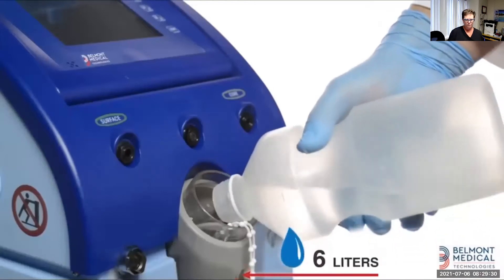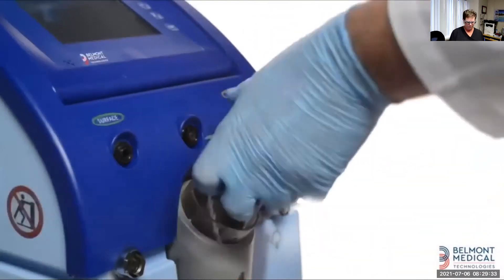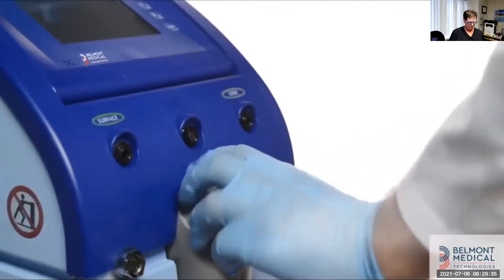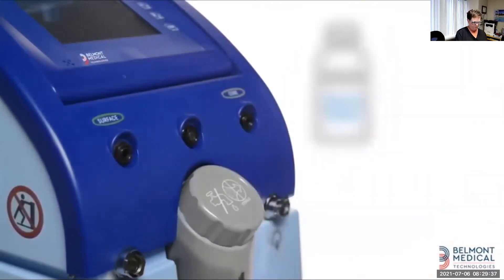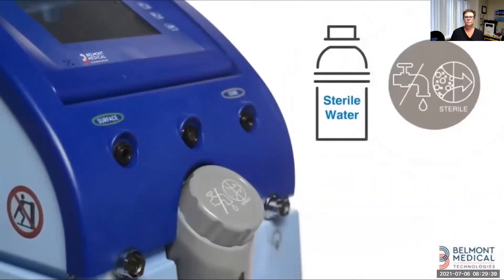First, fill the water tank up to the upper level line. A full tank has six liters of water. The system uses only sterile or 0.22 micron filtered tap water. Make sure to use only these kinds of water.